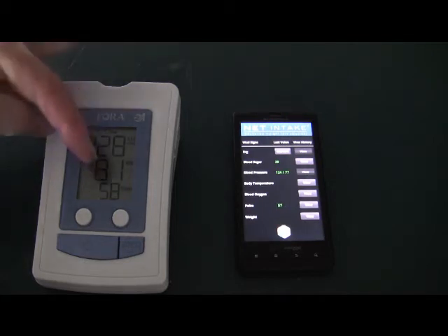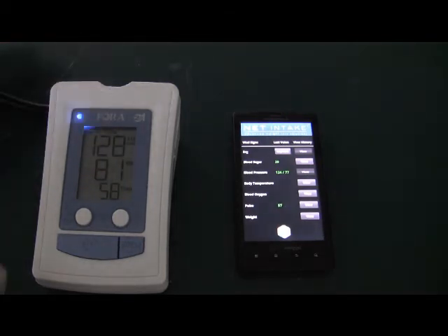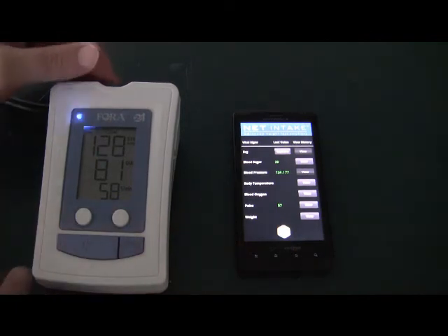We've captured 128 over 81 with a 58 pulse. Those values will be sent to the phone via Bluetooth.